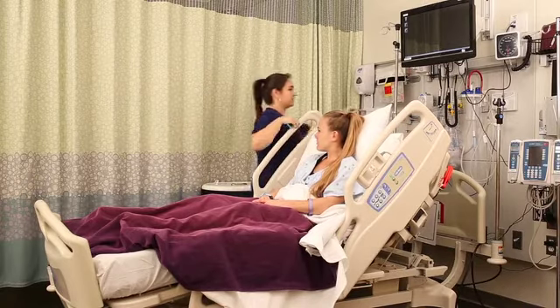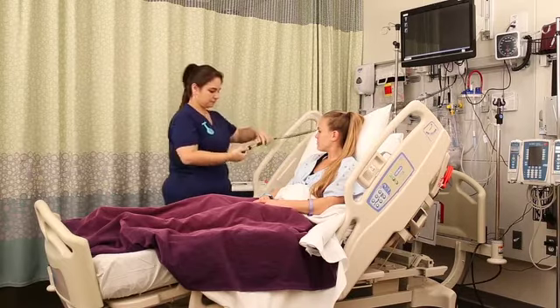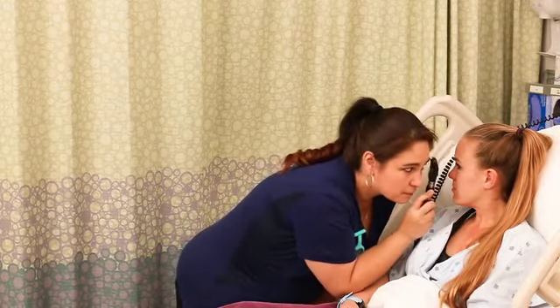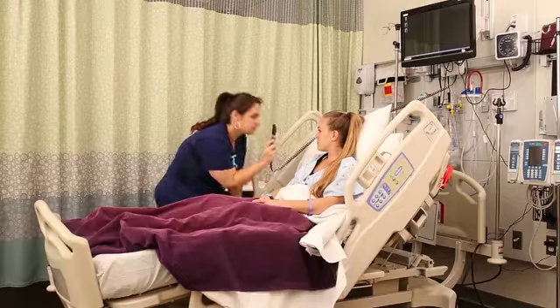Now you want to grab your ophthalmoscope, turn the light on, and check inside the eyes. You're looking at the retina and the optic disc, which is on the medial side. The retina should be orangey red with some blood vessels visible. You should also be able to see the red reflex when you shine the light towards the pupils.